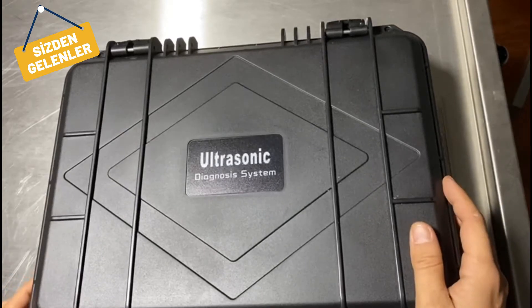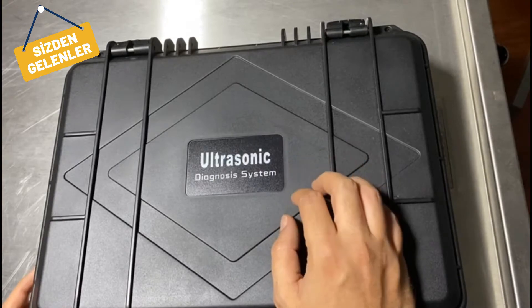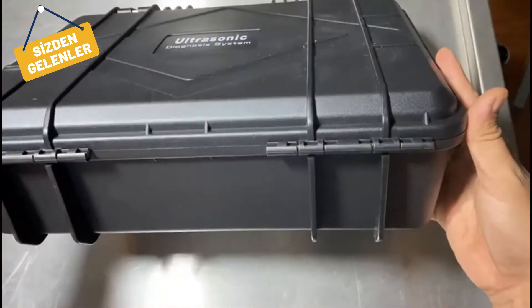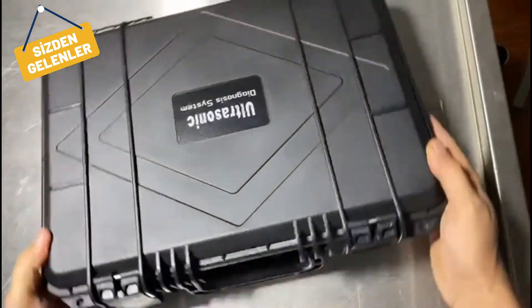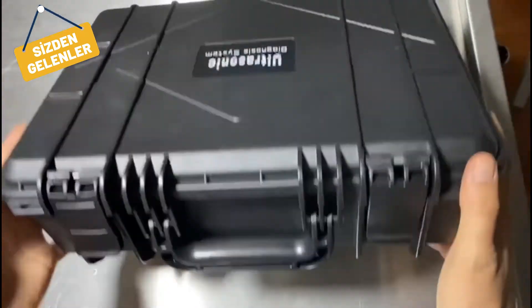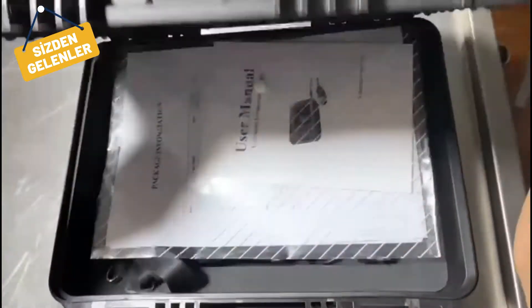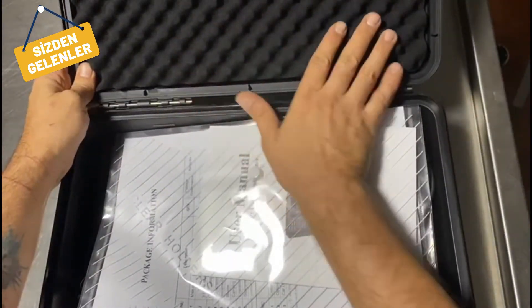At last we have received our ultrasound device from Selvet. At first look, it came with a sturdy case which you can use on all air conditions and all types of farms. It's locked quite well and it has a protective layer inside.